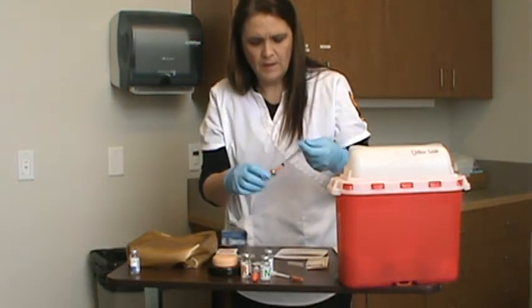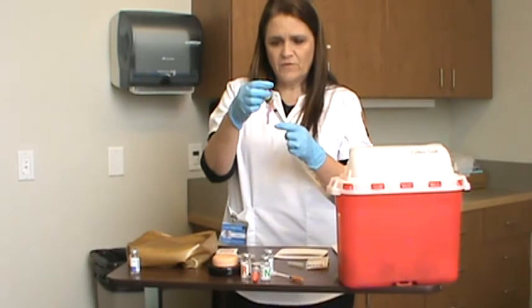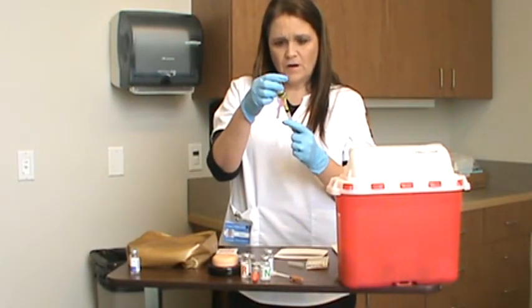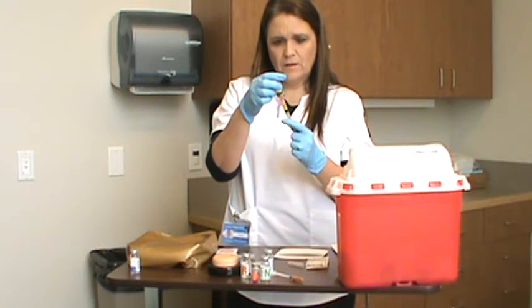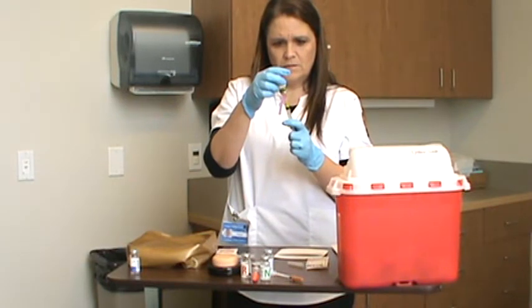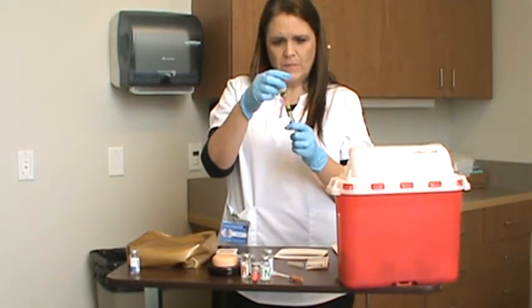Also with my IM injections, that I failed to mention when I gave my first one, when you give the injection, you want to make sure that you draw back a little bit so that there's no blood in your syringe, so that you know that you were in the right spot.